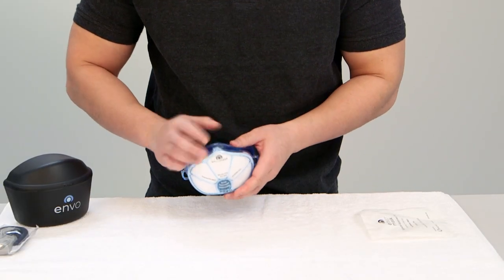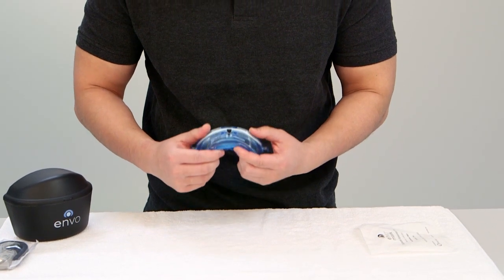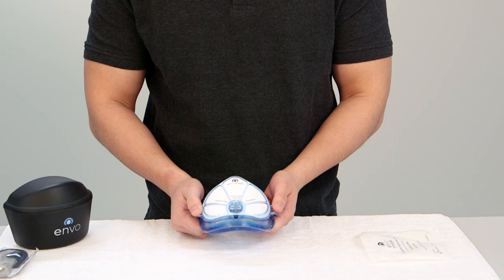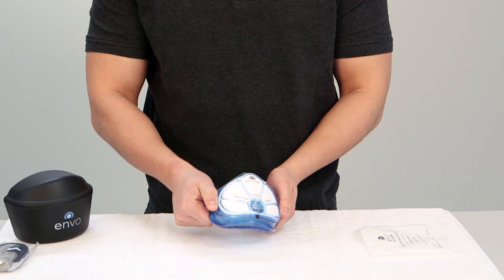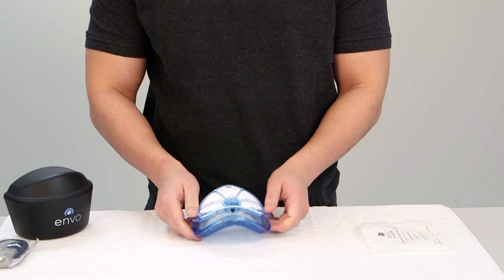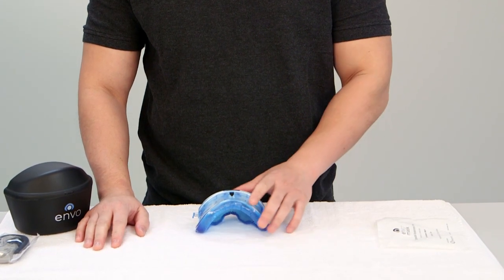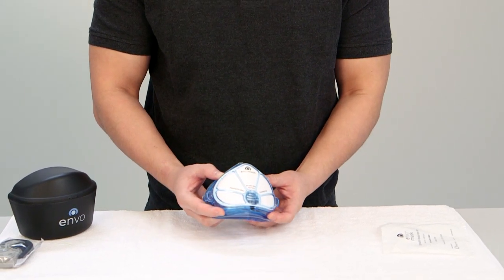To attach the filter cover to the mask body, align the top clip over the mask body's position pin and align the two arrows on the bottom. Once the arrows overlap, press one slot release tab until you hear an audible click. Then repeat this step on the other side. Take a moment to inspect the filter and verify the filter is still secured onto the fine grips.